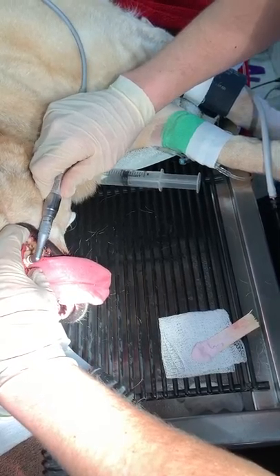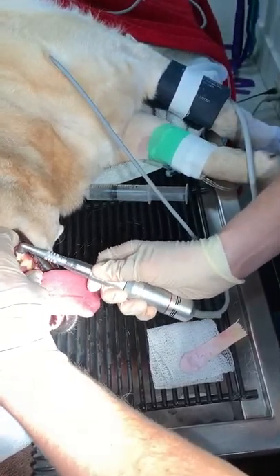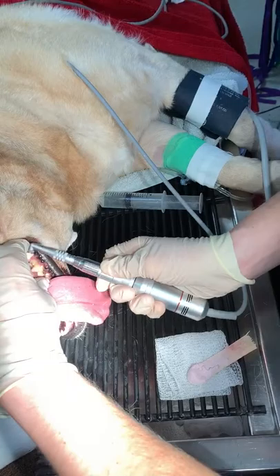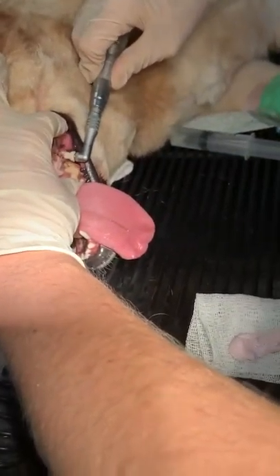So we're going to press this down here. We're not spending a ton of time — just kind of working our way over. This polishes off any superficial scraping of the tooth surface that we can't see and smooths it all up.